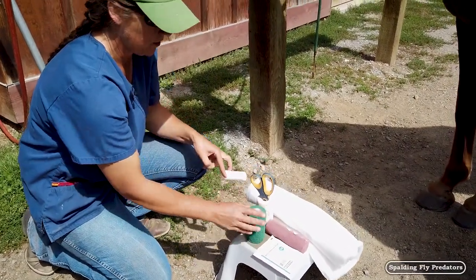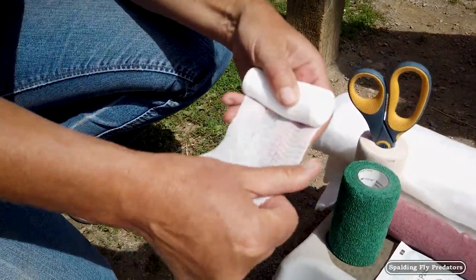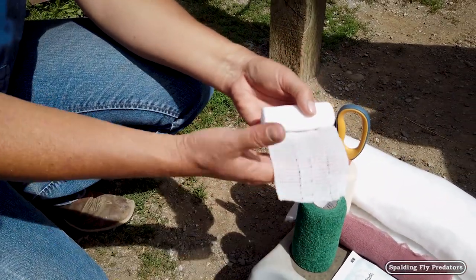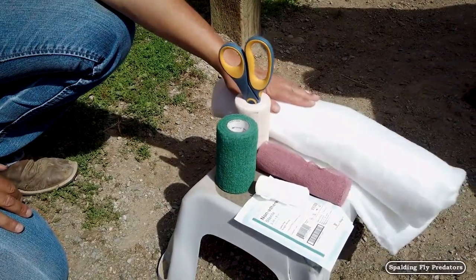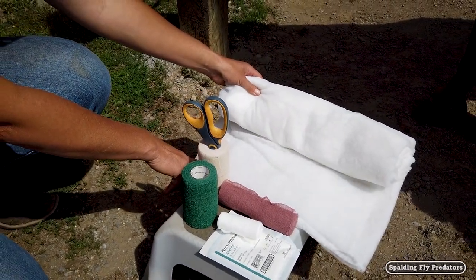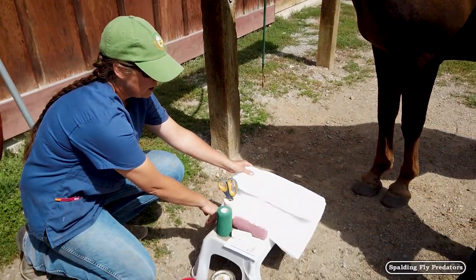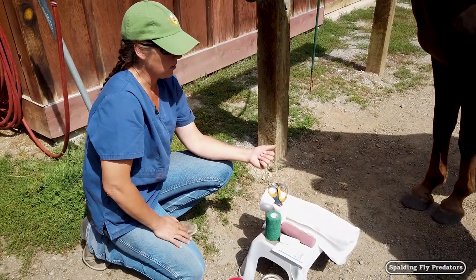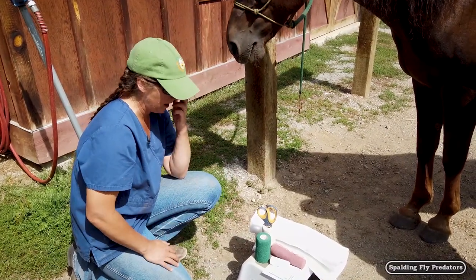The gauze pad is going to be held on with a nice cling wrap — cotton, stretchy, soft to the skin and non-abrasive. This will go directly over the wound pad and directly onto the skin. Our next layer is our cotton sheets, which is the most important layer for protecting all of the delicate structures in the leg. This provides enough cushion padding that we can put on a long-term standing wrap without having to worry about a tendon bow or injury from the vet wrap causing constriction on that leg.